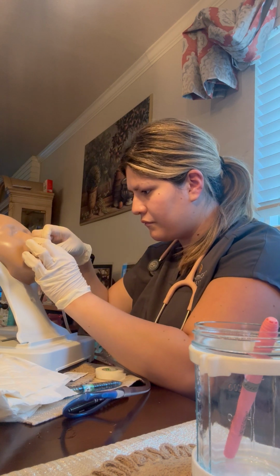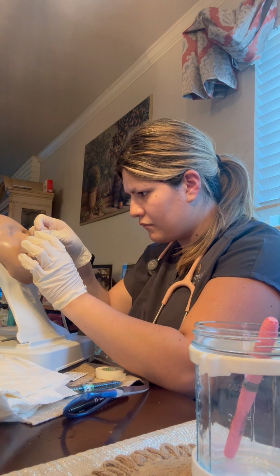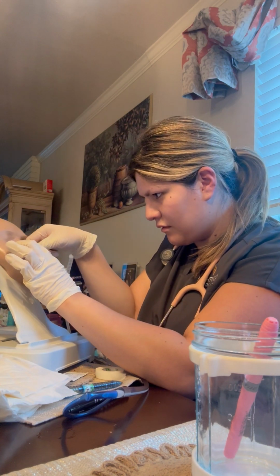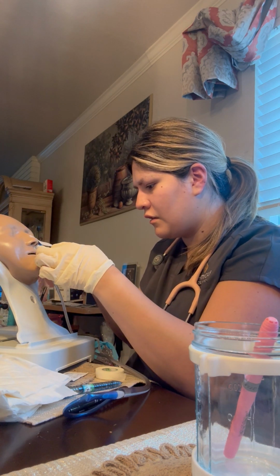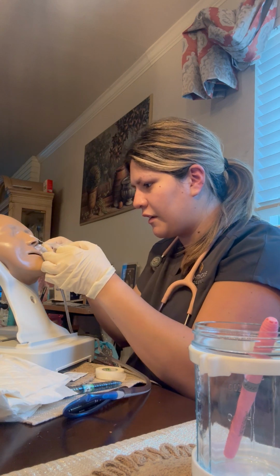In the bridge of the nose. And then I'm going to, you would have the right tape for this, but I'll just make my own tape. Okay, perfect.